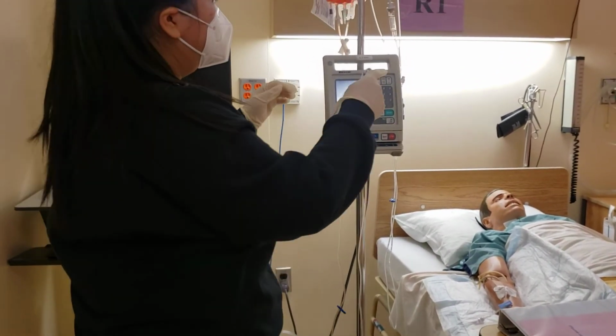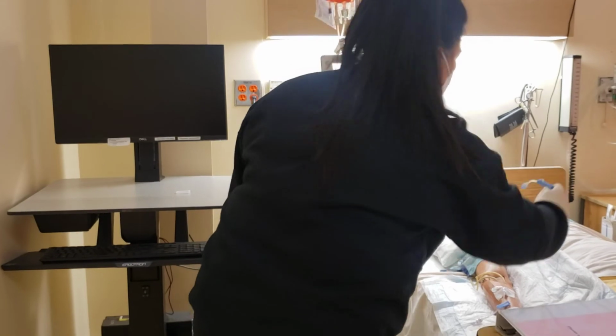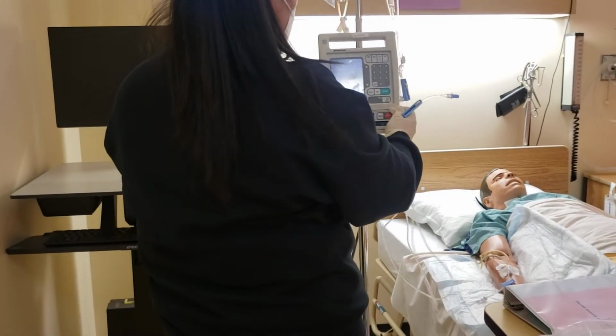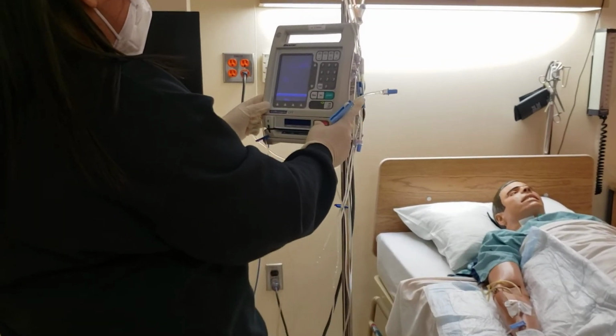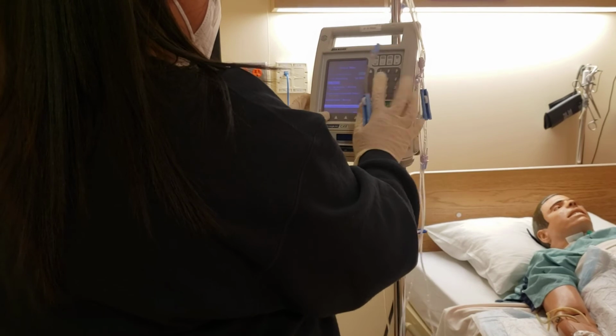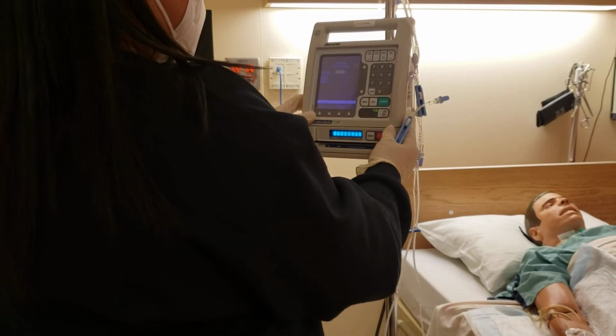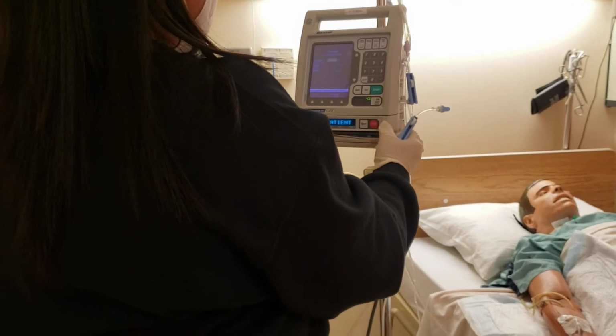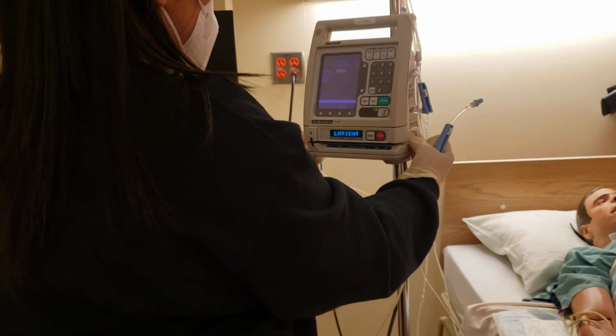The next thing I'll do is put my blood product into my pump. We'll hit open, primary, open. I'm going to spike my bag.